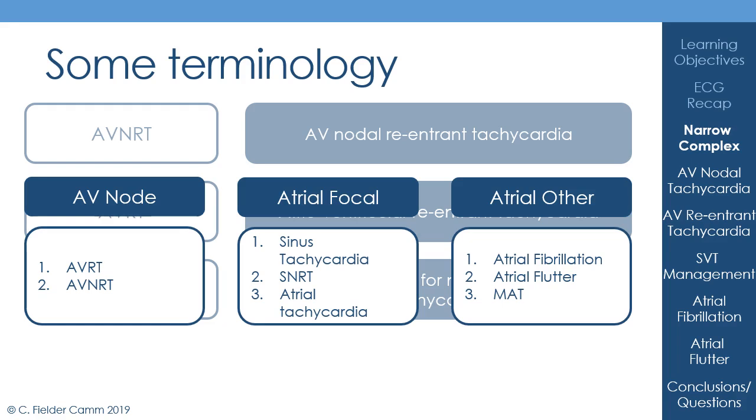And then you've got this group of other atrial tachycardias, and in particular I will discuss atrial fibrillation and atrial flutter. I'm not going to spend any time talking about multifocal atrial tachycardia, but if you're interested in it, there's plenty online for you to look at. So yeah, these are the four that I think we're going to discuss in the lecture today.